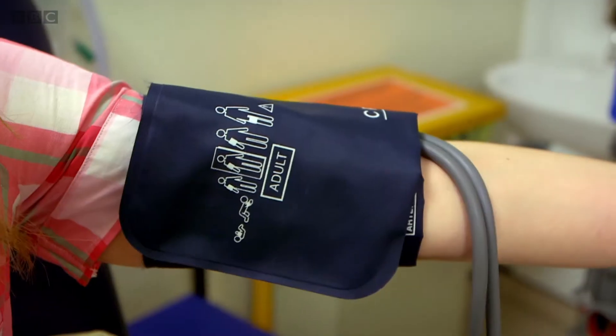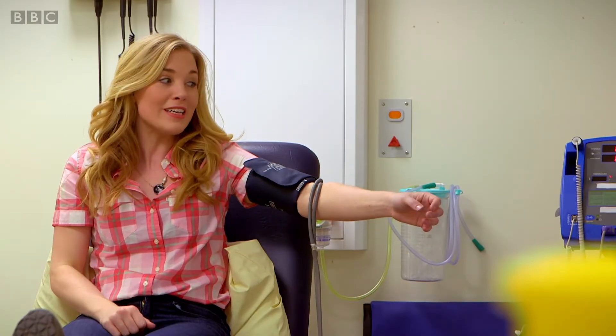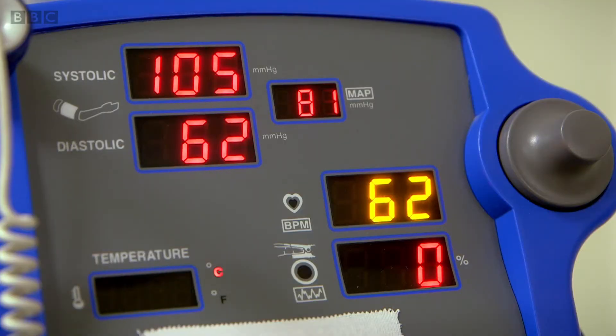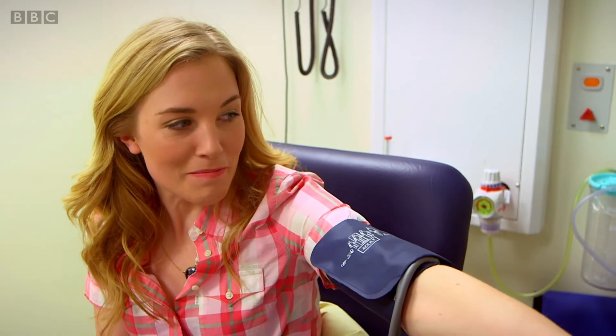I can feel the cuff getting tighter and tighter. It's a bit like having your arms squeezed but it doesn't hurt. When it's ready we'll hear a little beep and that will tell Amanda it's ready so she can check my blood pressure. And that was the beeping sound. If you look at the monitor you can see there are two numbers and those numbers will tell Amanda if my blood pressure is okay.